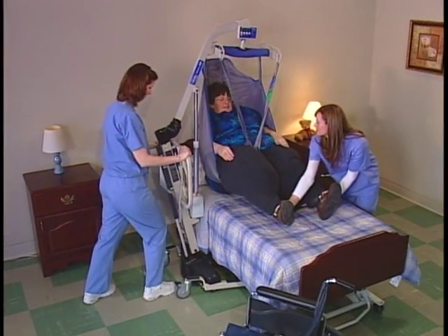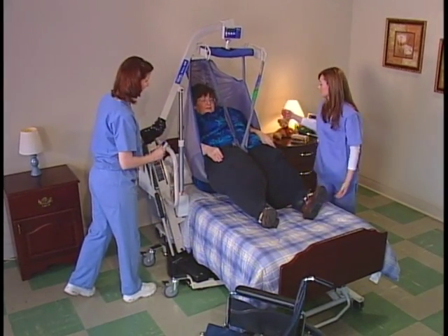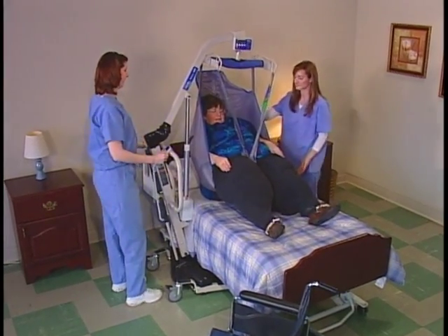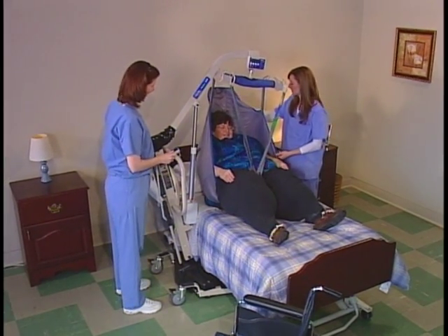Although one lift will work for most residents, it's recommended that each resident be issued their own individual sling that conforms to their weight, medical condition, and type of transfer that will be performed.